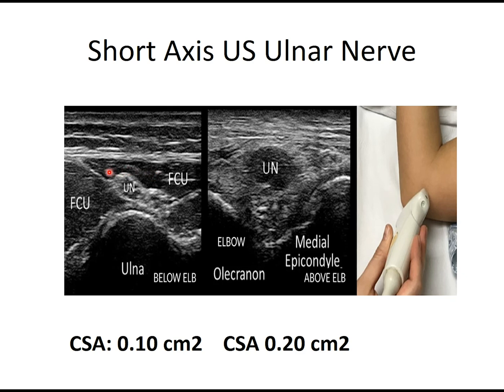The aponeurosis forms between the two heads of the flexor carpi ulnaris muscles, and we measured the cross-sectional area at 0.1 square centimeters. We then measured it a little more proximally in the retrocondylar groove between the medial epicondyle and the olecranon.